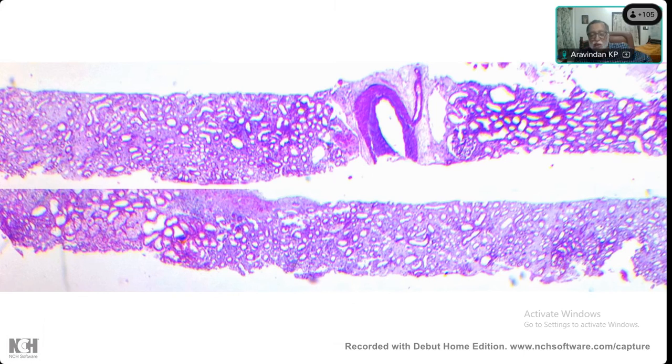I would prefer a high power view. Okay, very good. If it is fibrosis, then the history should have been a long history. And in order to know whether it is really fibrosis or not, any other special stain that you would do? The Masson trichrome may help sometimes. Masson trichrome, yes, sir. Of course, with high power, if you are sure that it's edema, you don't really need that.